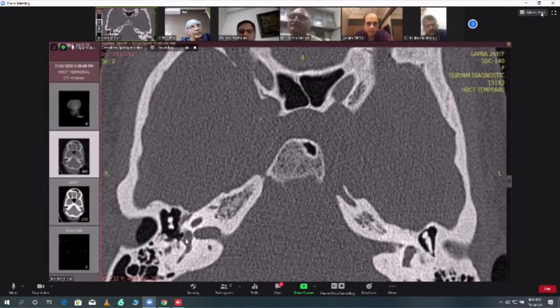Fixation of malleus. Yes. Do you recommend CT scan for all the stapes cases or for selective cases? All, by default. A 0.5 mm cut is a must. All stapes, CT scan, all stapes titanium piston by default, and 0.5 mm cuts.